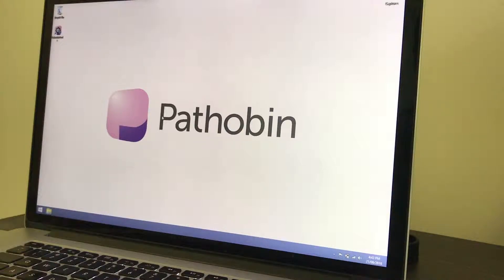Hi, this is Dr. Shane Batty, pathologist, and in this video I'll demonstrate how Pathobin Tools' new real-time stitching function works.